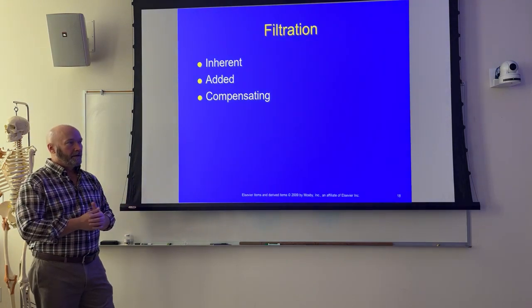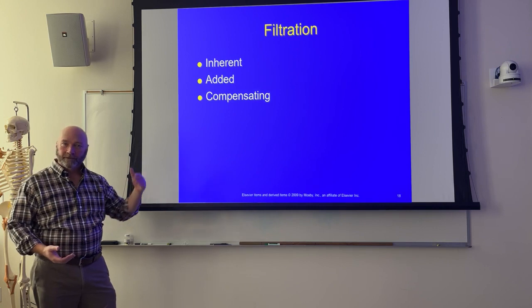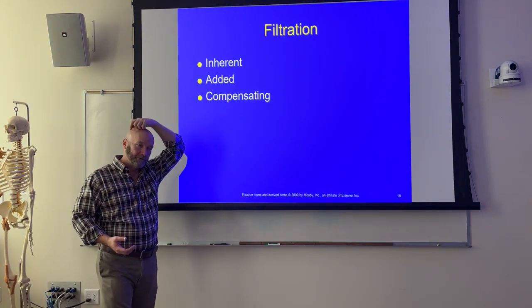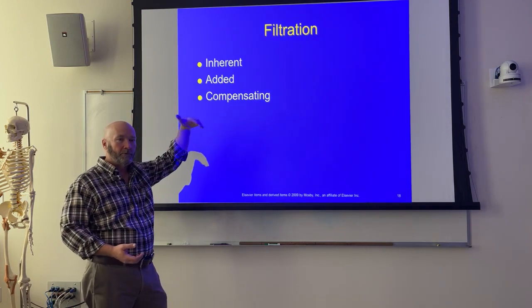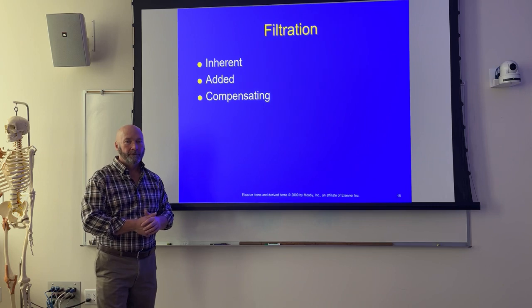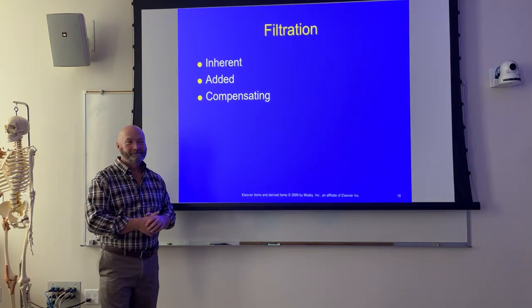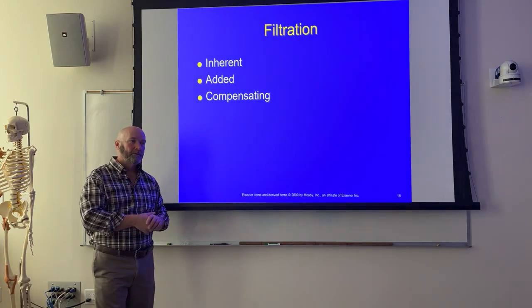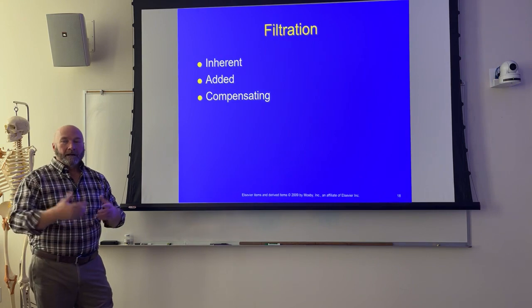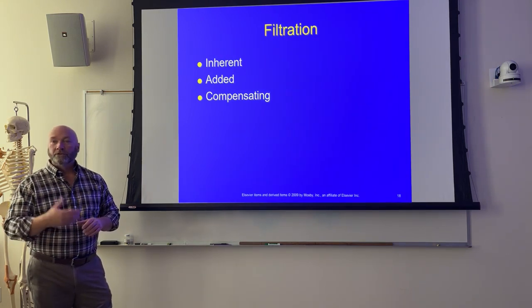So, I've never worked in a pediatric hospital, but I can see in a pediatric hospital where they might use higher levels of filtration. What was filtration originally utilized for? We talked about that last semester. What was the purpose for filtration? Get rid of the lower energy x-ray photons. They're not going to make it through the patient anyway, right? So they just add to the patient dose, and they're useless.